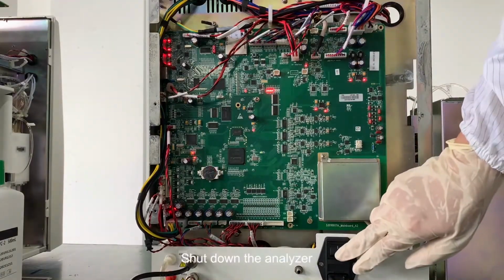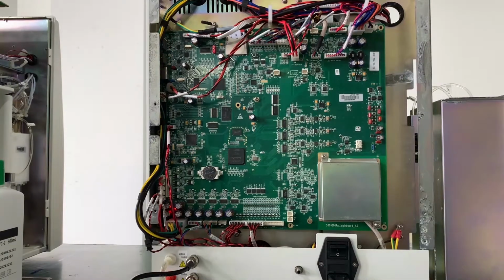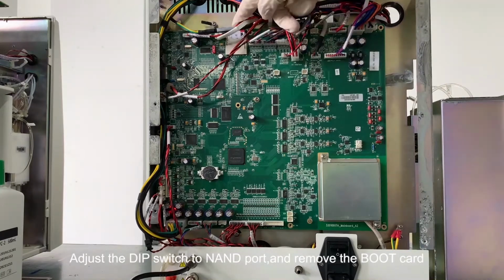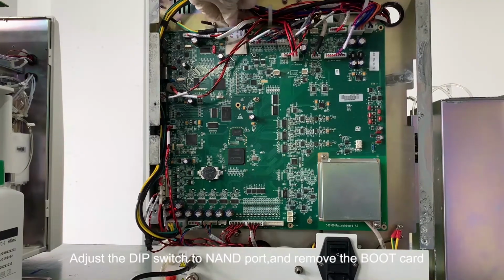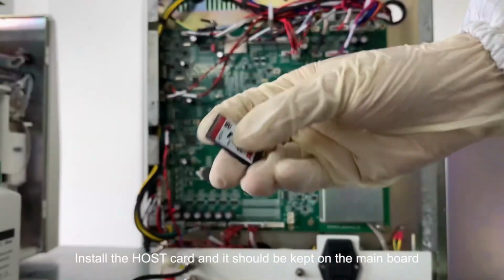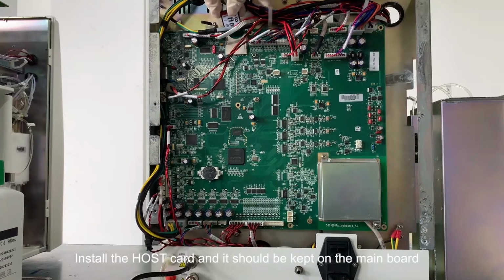Shut down the analyzer. Adjust the DIP switch to NAND port and remove the boot card. Install the host card and it should be kept on the main board.